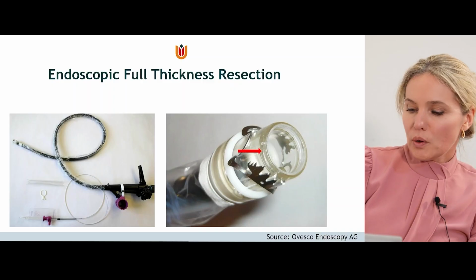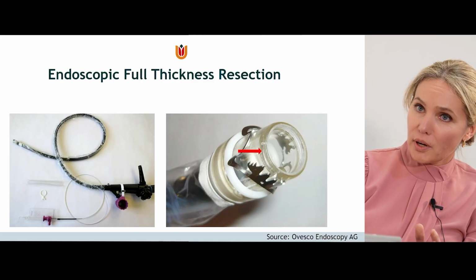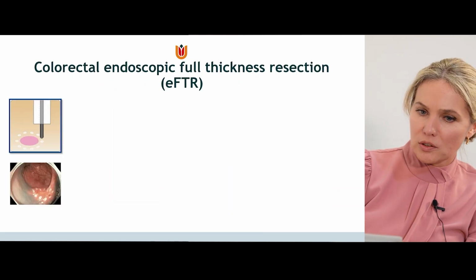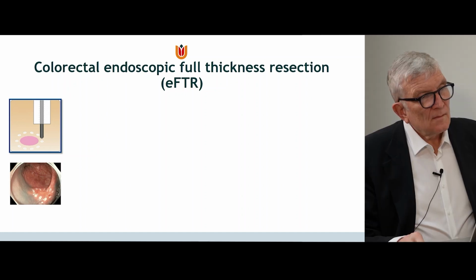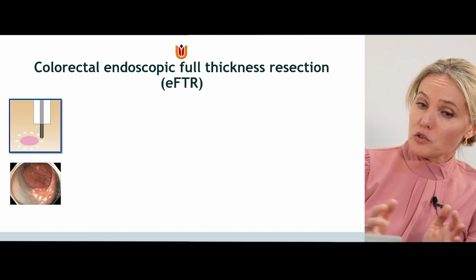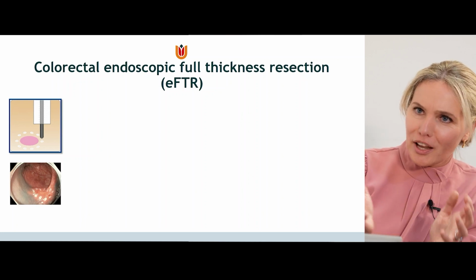Okay, we get that. So above the rectum or proximal rectum, maybe you can show us quickly how this procedure is performed in the suitable lesions. Yes, sure. Endoscopic full thickness resection and the FTRD system is the only system that integrates tissue resection and closure of the perforation in a one-step integrated procedure. It's very important, of course, that we follow the right sequence of steps of the procedure. First of all, we need to recognize the lesion, which can be difficult with the long cap because it takes a lot of light and visibility.